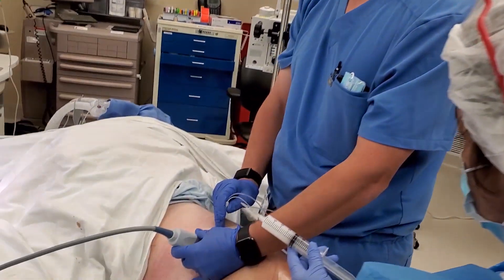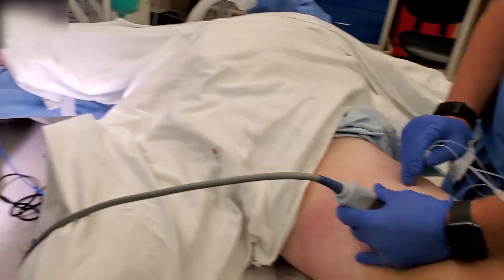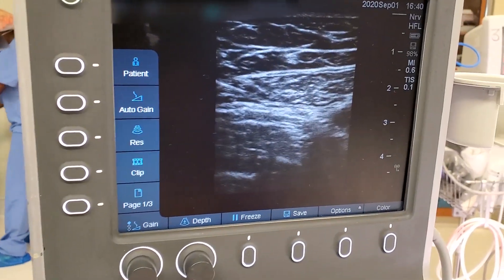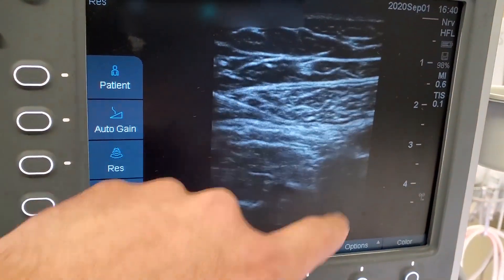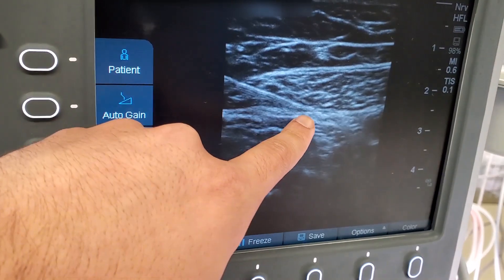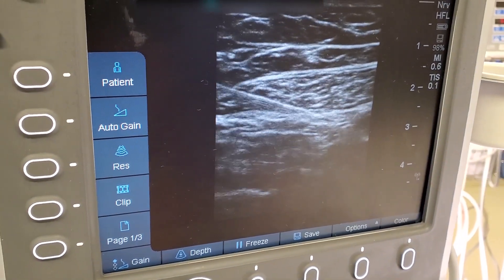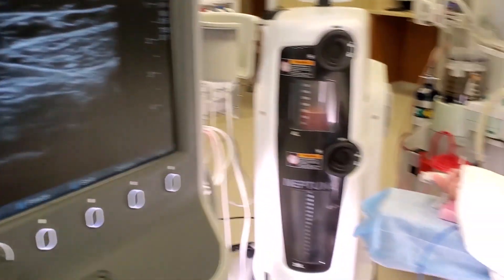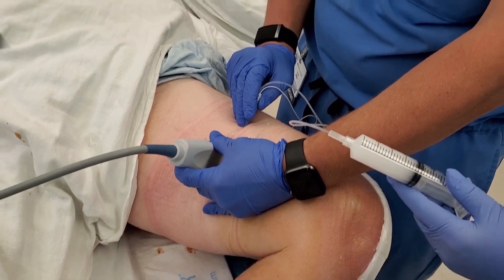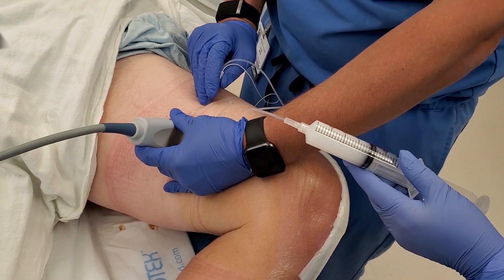As you can see, he is on the medial aspect of the thigh, and on the image here we have a great view of the superficial femoral artery. This is the sartorius muscle, and you can see his needle coming in right here. It's very hard to see, but you can actually kind of see the saphenous nerve there. For a total knee, we're going a little bit more proximal just to get what's called the nerve to vastus medialis for the knee.